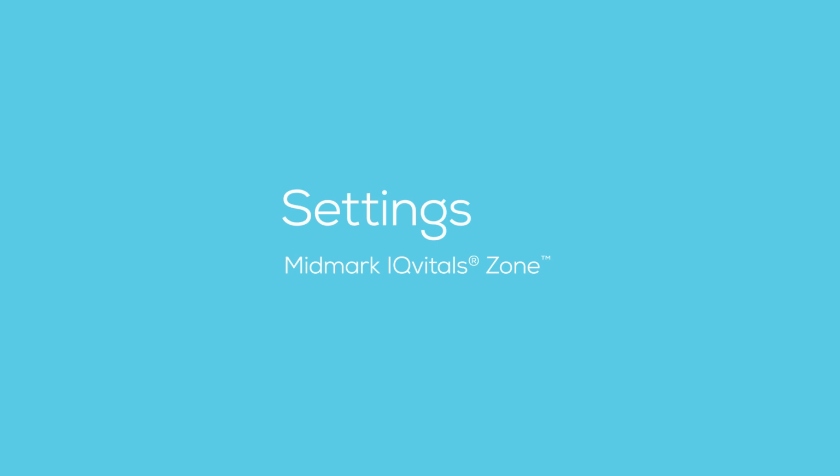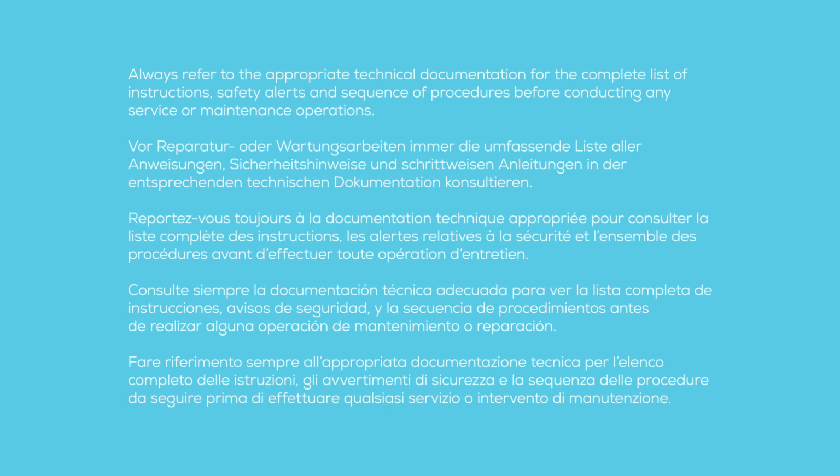This video is an overview of the Midmark IQvitals Zone vital signs device settings. Always refer to the appropriate technical documentation for the complete list of instructions, safety alerts, and sequence of procedures before conducting any service or maintenance operations.